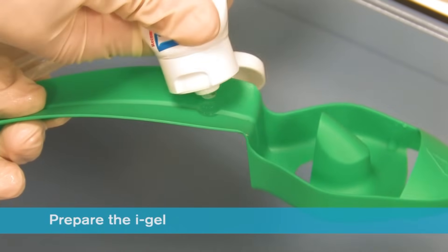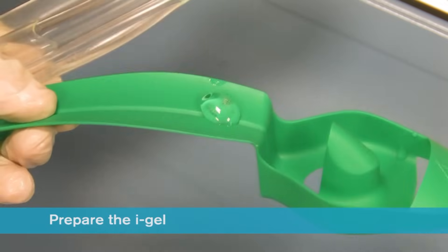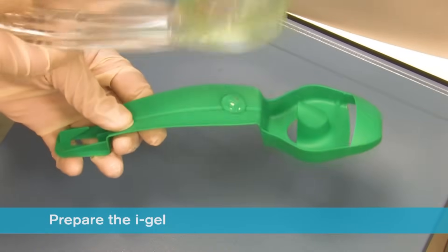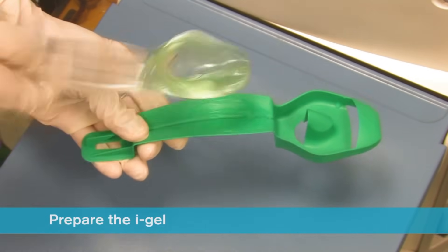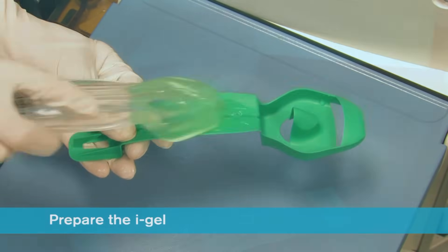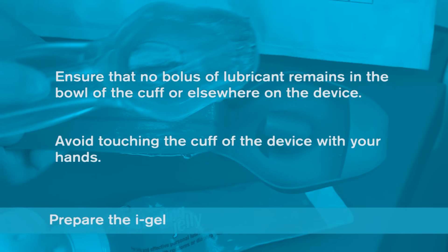Place a small bolus of water-based lubricant, such as KY Jelly, onto the middle of the smooth surface of the cradle in preparation for lubrication. Do not use silicon-based lubricants. Grasp the iGel with the opposite freehand along the integral bite block and lubricate the back, sides and front of the cuff with a thin layer of lubricant. After lubrication has been completed, check that no bolus of lubricant remains in the bowl of the cuff or elsewhere on the device. Avoid touching the cuff of the device with your hands.